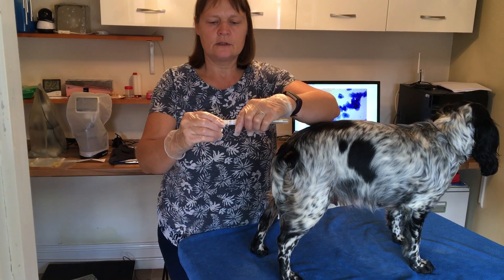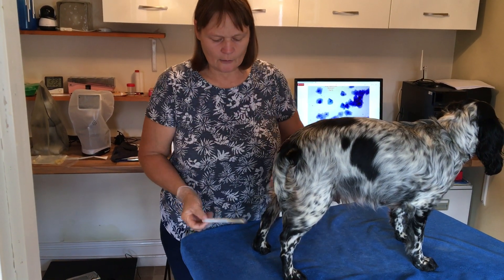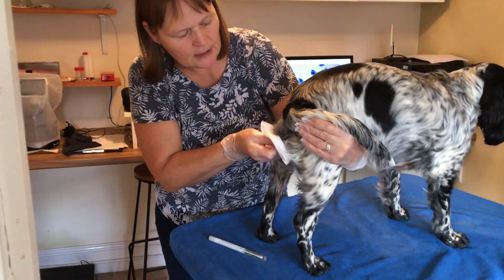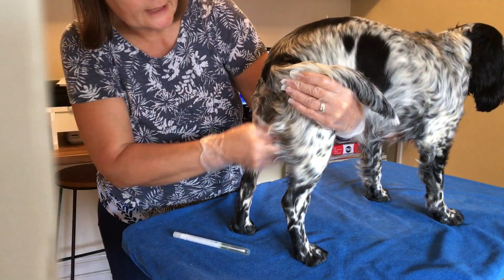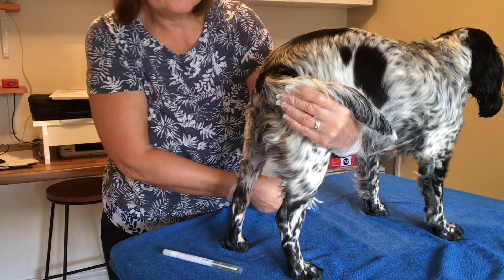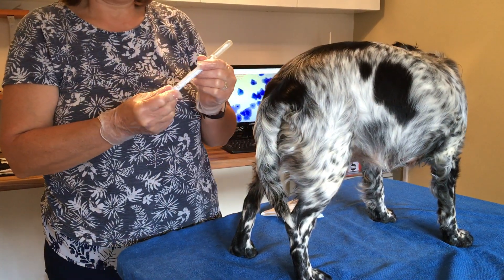That's totally sterile, don't touch it, ready to go. But before you start to insert your swab, what you need to do is just clean up this area, clean up the vulval region. Make sure there's no dirt, remove excessive bleeding, and then prepare your swab.